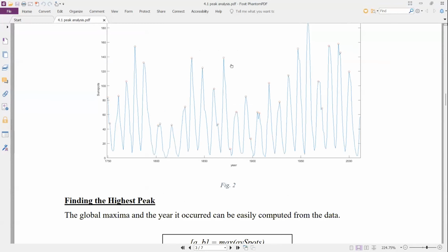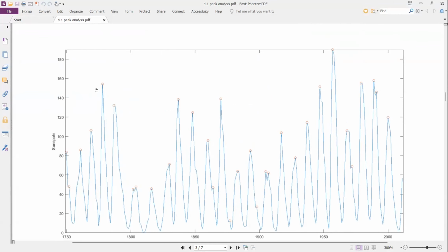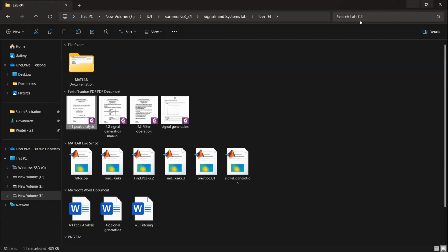For instance, this is one signal. It is a periodic signal, and you can see these are the peaks. There is a function in MATLAB where you can find the peaks, so this is where the peaks are happening. You can identify each peak, and from this peak to this peak, you can identify the difference. The same concept you can use for your PQRST. Peaks are where you have the highest value compared to the neighborhood values. This is a peak because it is higher than its neighborhood.